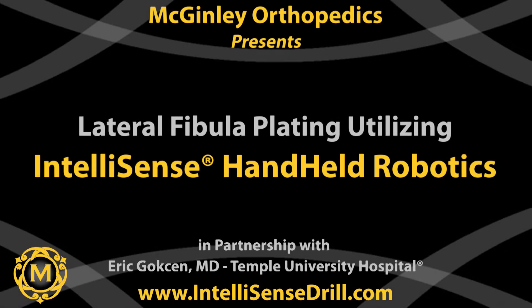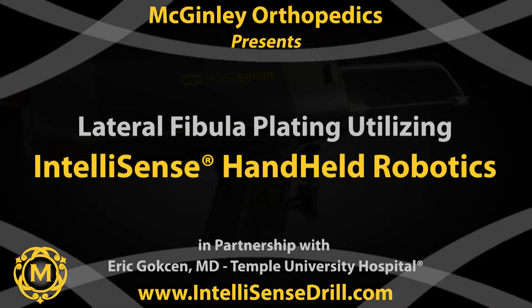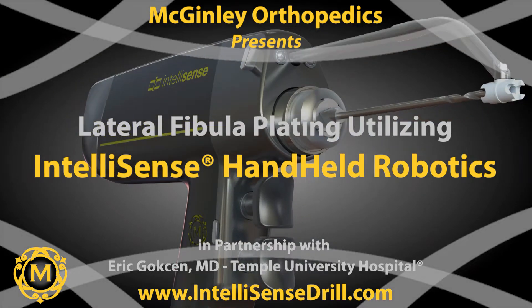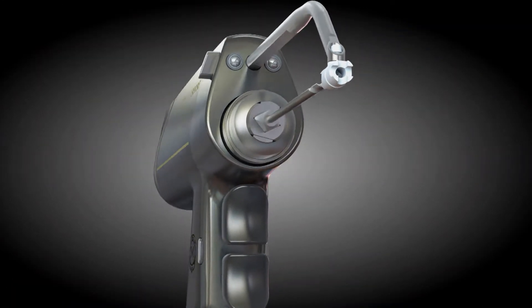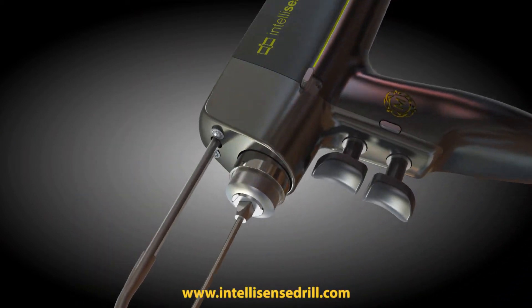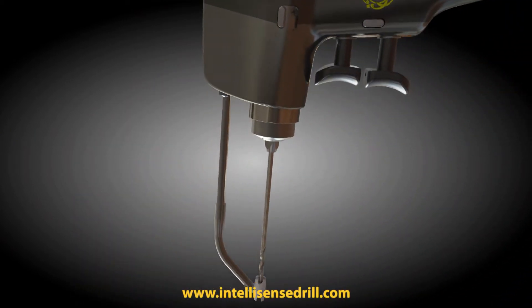McGinley Orthopedic Innovations, in partnership with Dr. Eric Gokcen, presents a cadaveric lateral fibula plating using IntelliSense handheld robotic drill technology. McGinley Orthopedics aims to lead innovation in orthopedic surgical instrumentation with new technologies that protect patients, improve outcomes, and reduce cost.